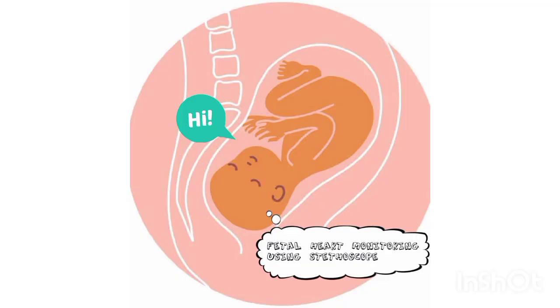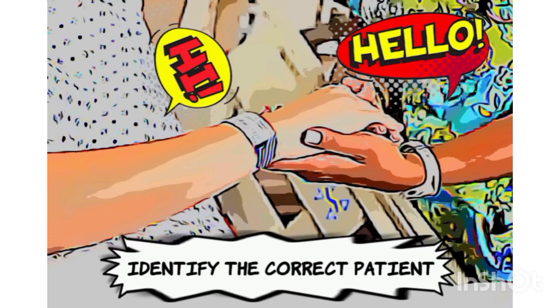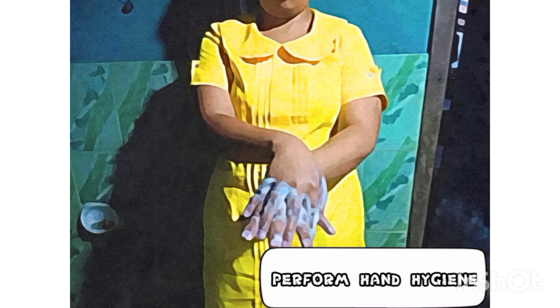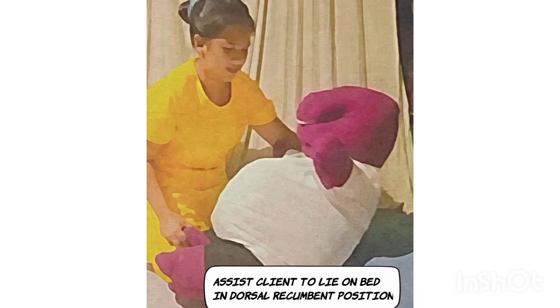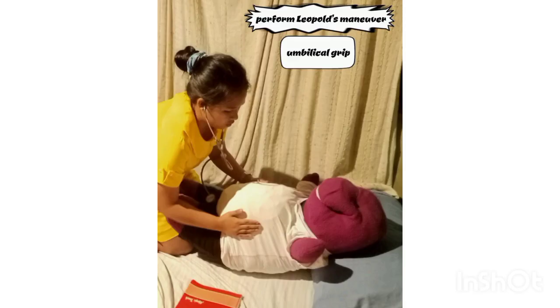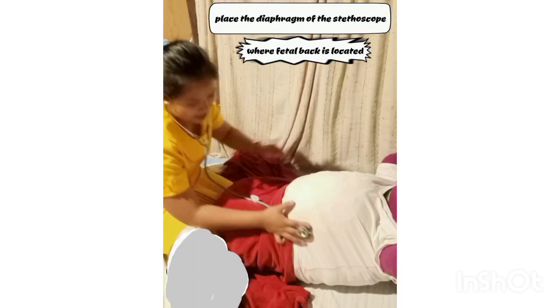Fetal heart monitoring using stethoscope. Identify the correct patient. Introduce yourself. Hello, good morning. My name is Melana J.D. Molina. I will be your nurse for today. Perform hand hygiene. Assist the client to lie on bed in dorsal recumbent position. Expose the part to be examined, keeping cover to the other parts. Perform Leopold's maneuver. The second maneuver, the umbilical grip. Place the diaphragm of the stethoscope on the client's abdomen where the fetal back is located.